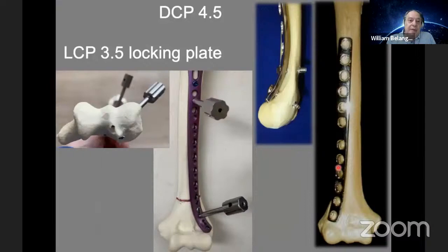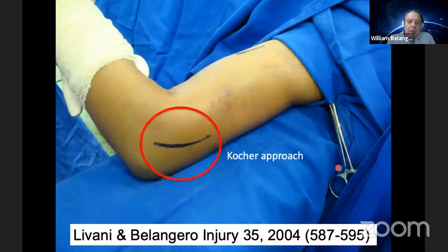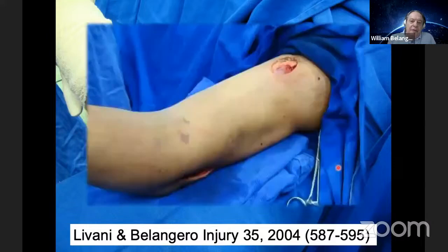We can use a locking plate, but this is a 3.5 locking plate, which is easiest to mold, and then you can use it in the distal fragment using locking screws. You can put 3 locking screws. This is the approach, a Kocher approach. You see the bone surface, it is very important to identify the bone surface.